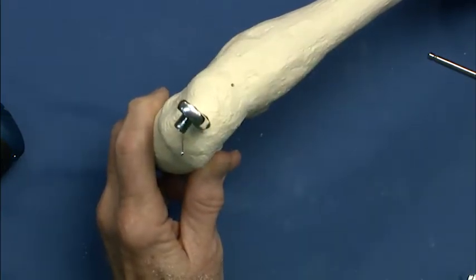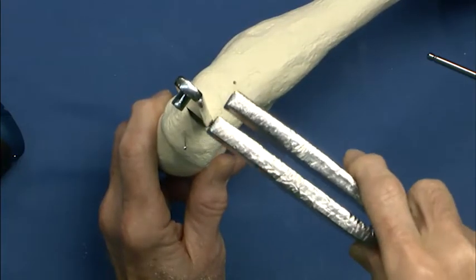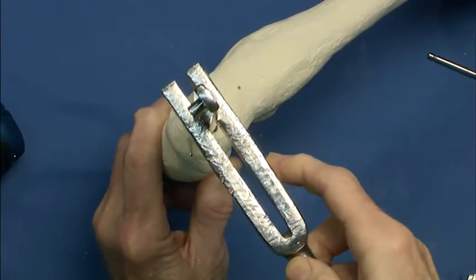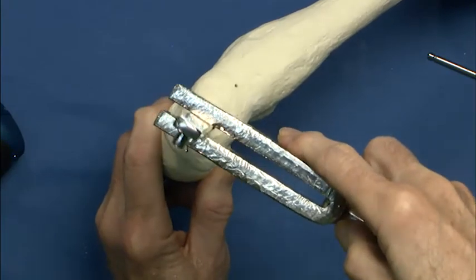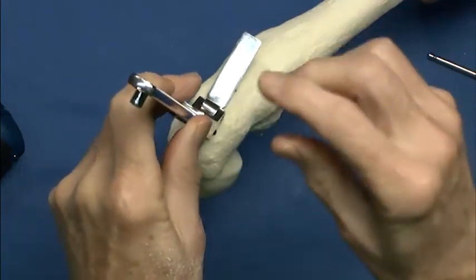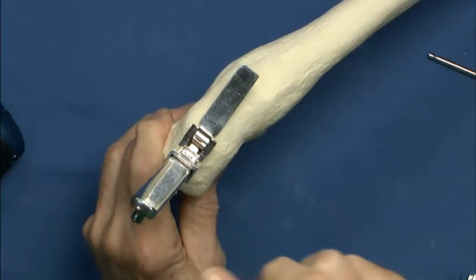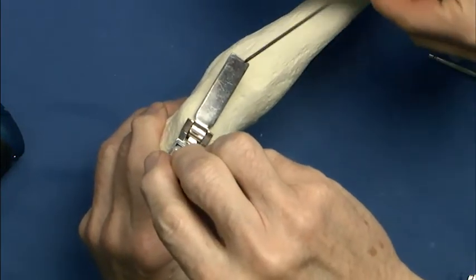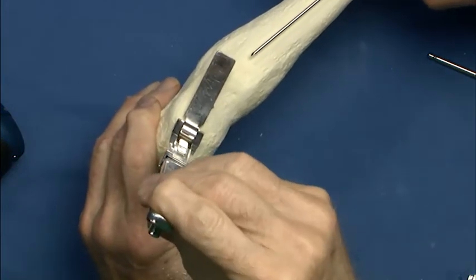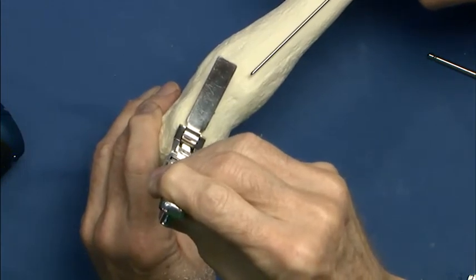Now what you can do is essentially change the position in the sagittal plane by twisting with the tuning fork, this clever little device. And you can change this as much as you want in this position or in this position. And this is where our sagittal plane correction comes from, again, using the guide. This is our reference. So if we look at our correction, we're approximately parallel to the proximal segment with our 15-degree correction, and then we would have, in this position, a restored sagittal plane axis.